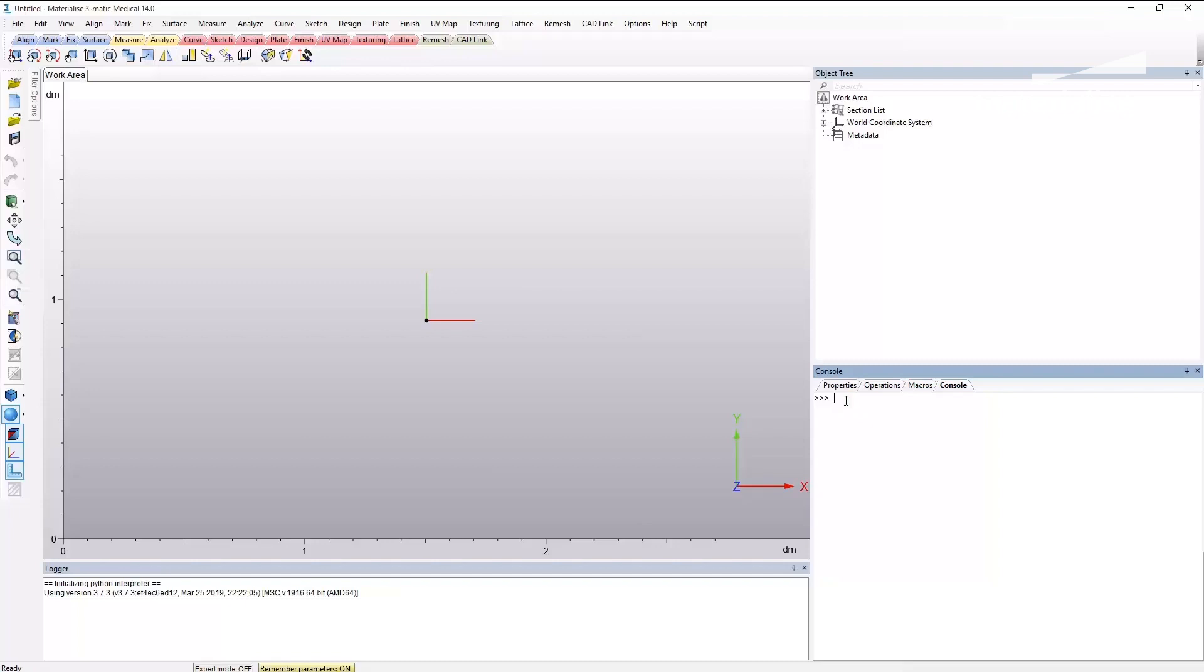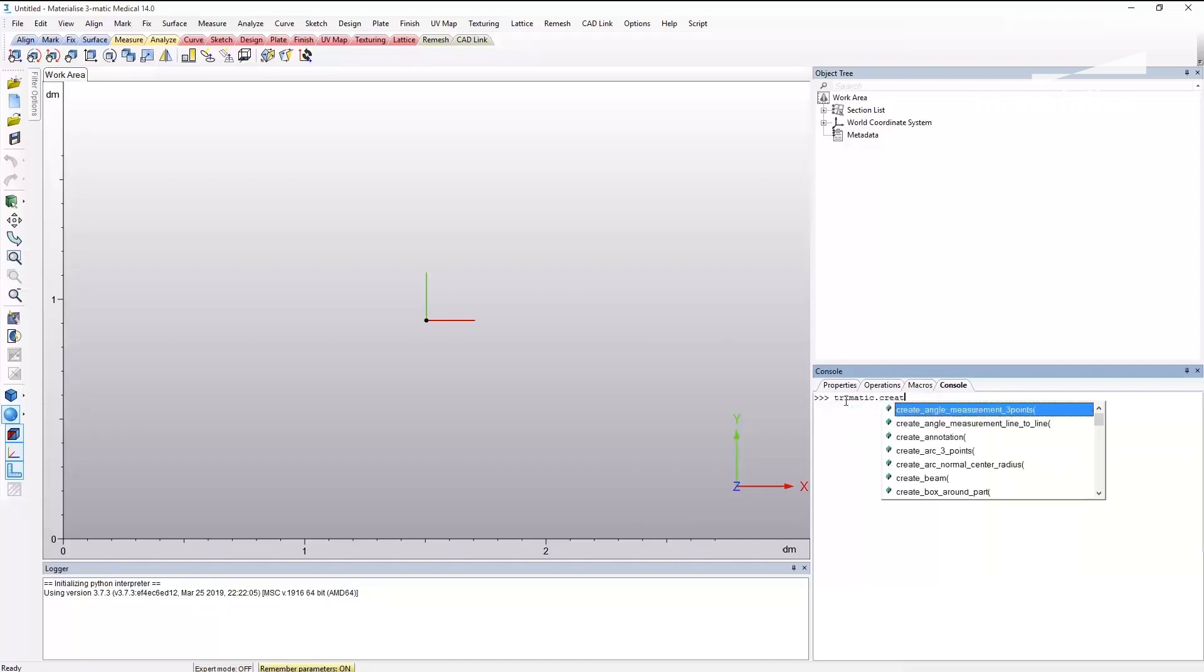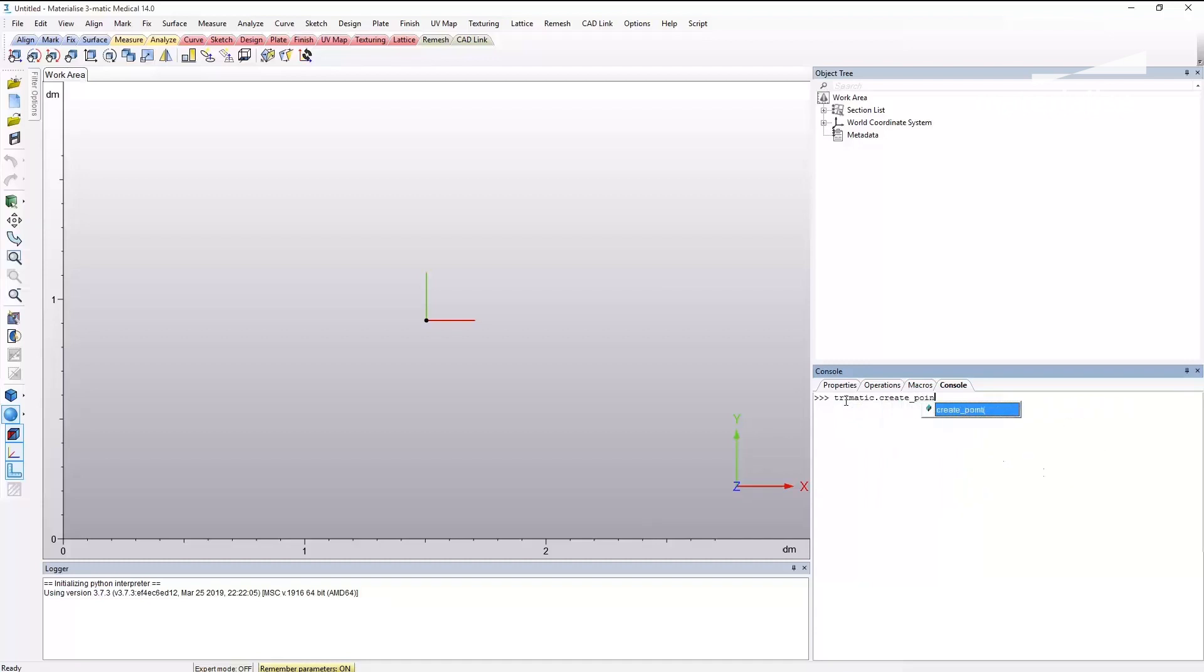You can test it out by typing 3-matic dot in the console. As you can see, the JEDI package added autocomplete to the console and editor of 3-matic. I am quickly creating a point to show you scripting is working.